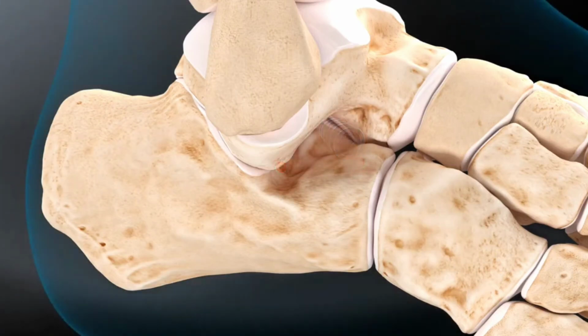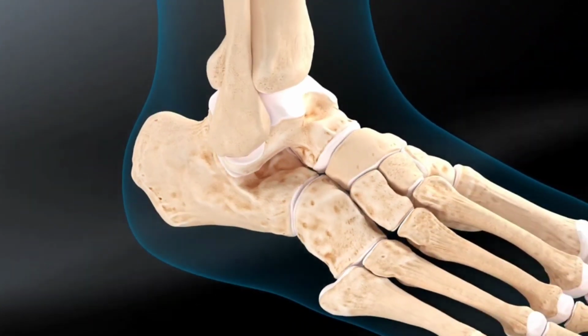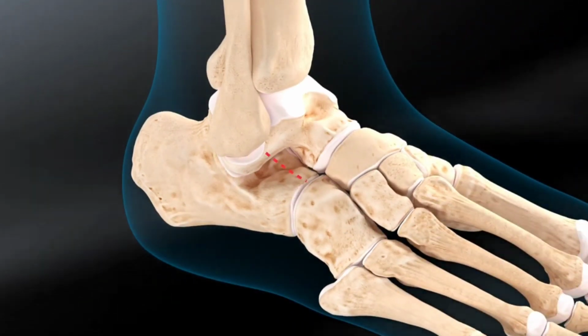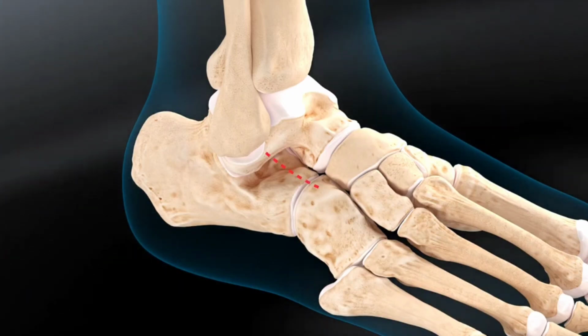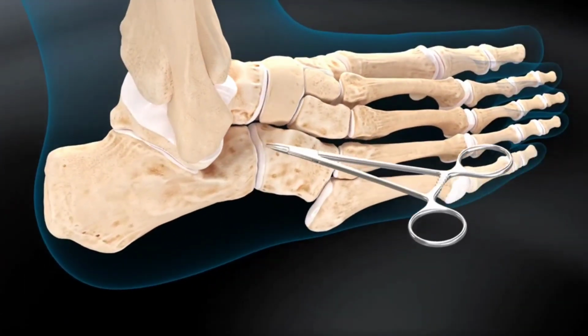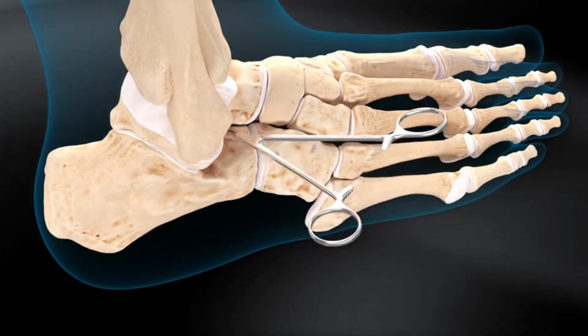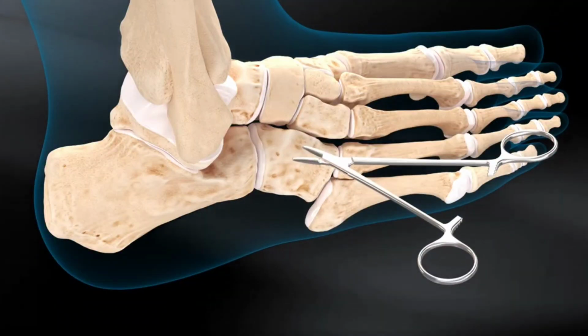The surgical technique to implant a ProStop subtalar arthroereisis implant is simple and straightforward. A skin incision is made in the soft spot of the sinus tarsi, just proximal to the anterior process of the calcaneus. Blunt dissection of the subcutaneous tissue is carried out with a hemostat. The dissection of the interosseous ligament is not necessary for this procedure.